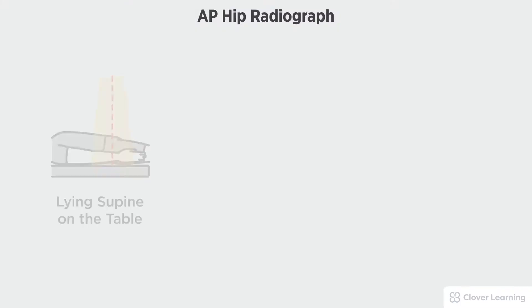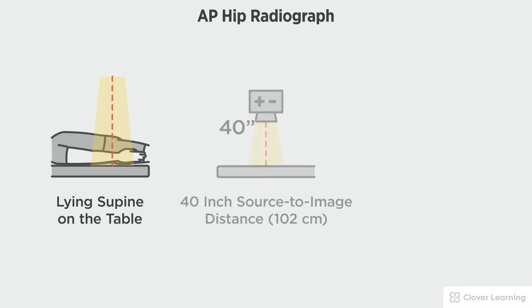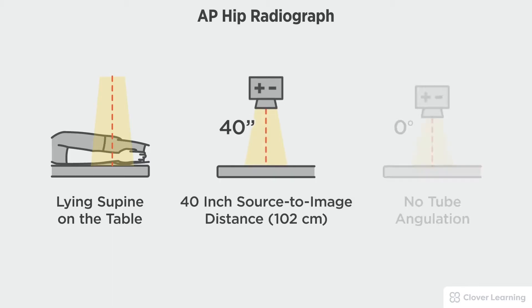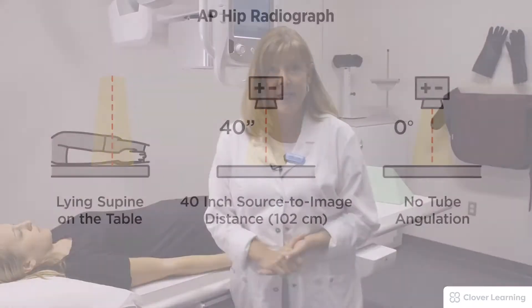In this view we will be demonstrating the AP hip. The AP hip should be performed with the patient lying supine on the table with a 40 inch source to image distance and no tube angulation.